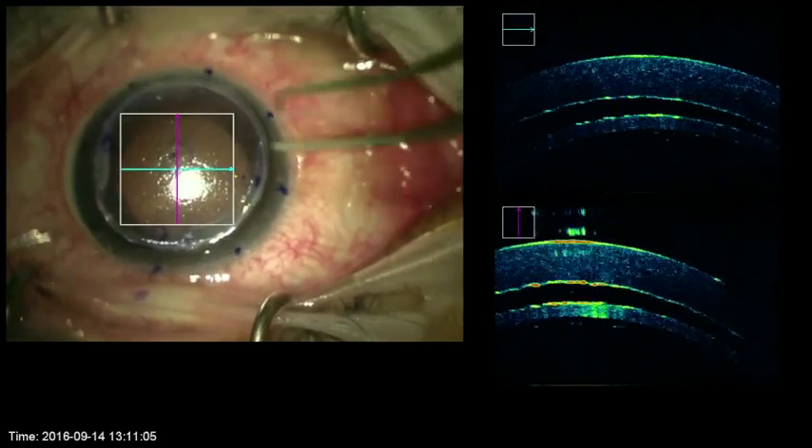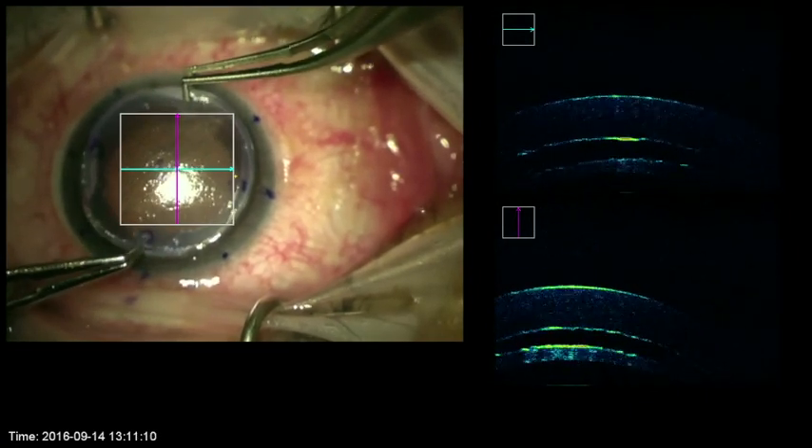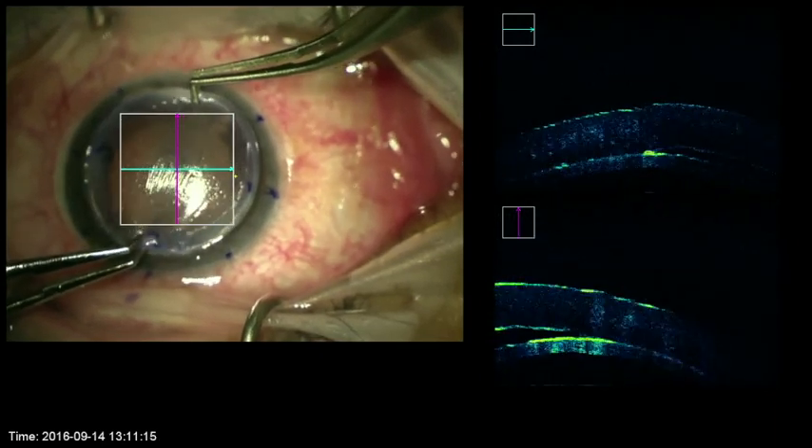Stretching of the tissue with forceps achieves good apposition of the donor and recipient, which can be confirmed with the OCT by seeing the disappearance of the potential interface.